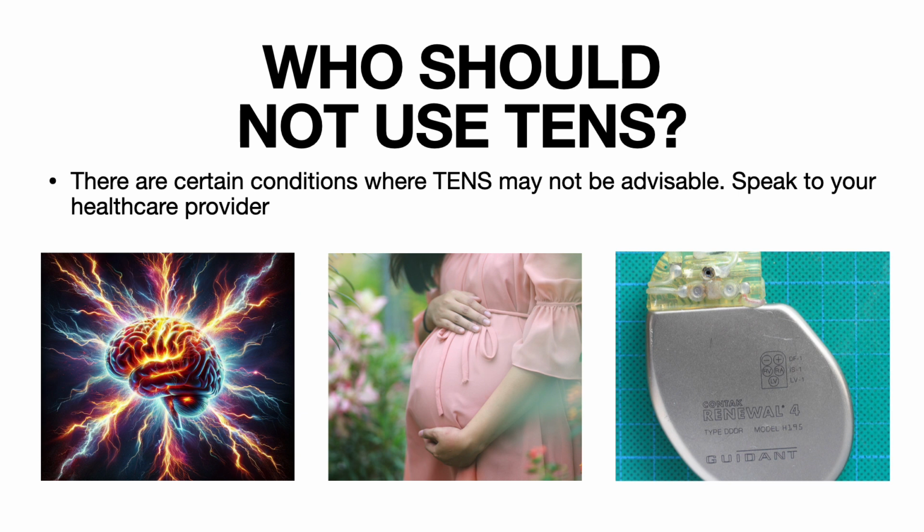So there are certain conditions, certainly, where TENS may not be advisable. Examples may include individuals who have a history of seizures or epilepsy, those who may be pregnant, or those who have implanted devices such as pacemakers, where there may exist the potential for that device to be interfered with by the electrical current coming from the TENS device.